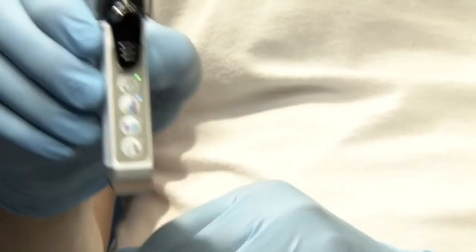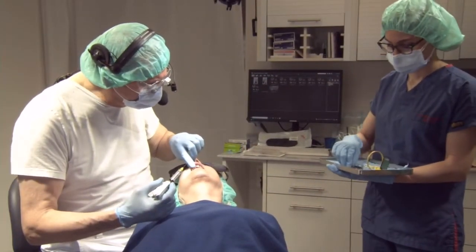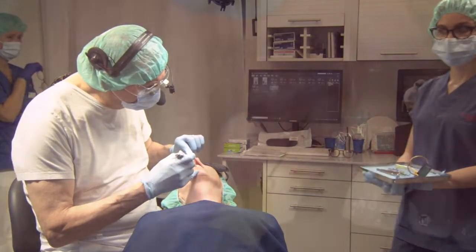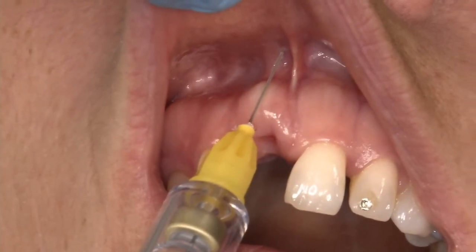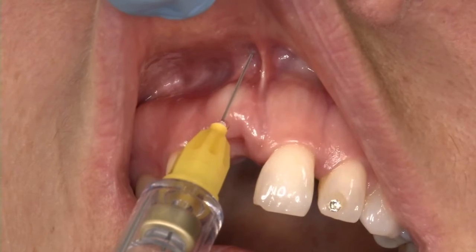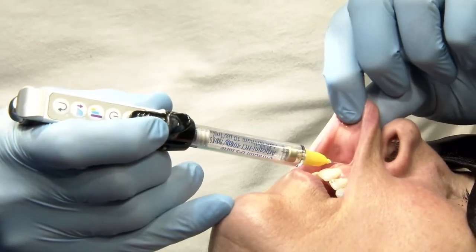I'll probably start with blue — that's the mid-size speed. I'll explain our situation, then you can see me go in here very carefully and press the button. Now you can see that the administration is being applied here — you can see how it is moving very slowly.